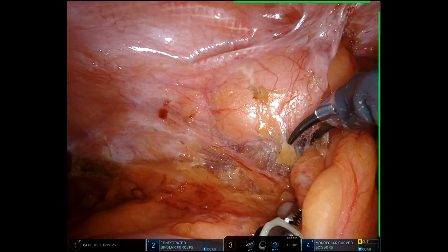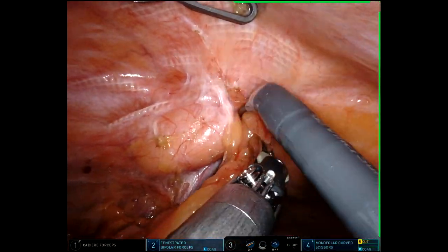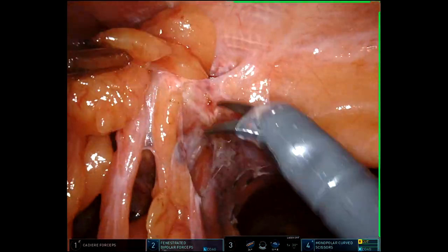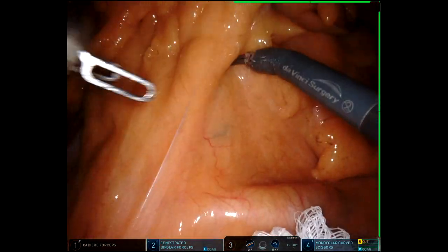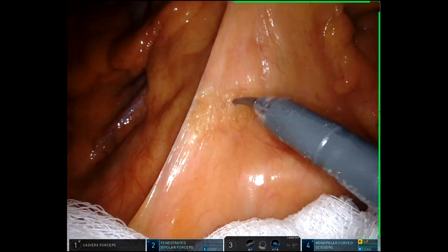Just so that I can get this down and then lift the pedicle — you can actually see that there's a wad of epiploic fat inside of a kind of a peritoneal hernia defect, and I'm working on getting that down. Once that's down, I'll go ahead and start my medial dissection.